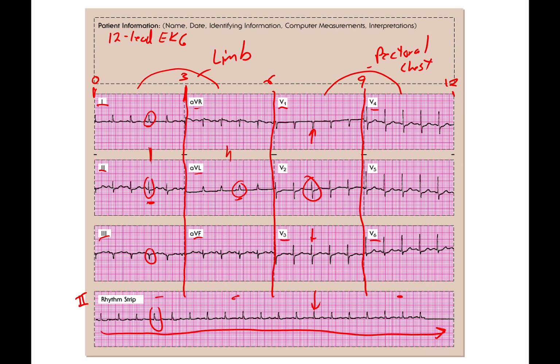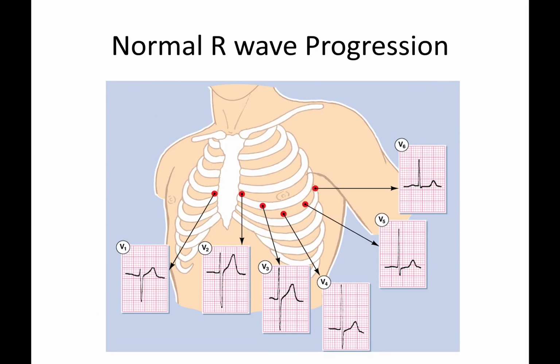The real big value of putting this all together is that in a 12-second period, assuming you get a nice clean 12 lead, you are looking at one continuous heart rhythm along the bottom, and then with that layering all of these different vectors, all of these different angles at which you look at the heart to come up with a nice overall picture. So that's the basics of a 12 lead itself.